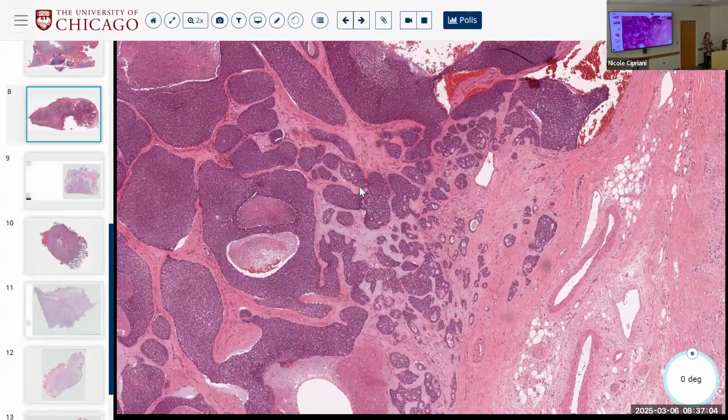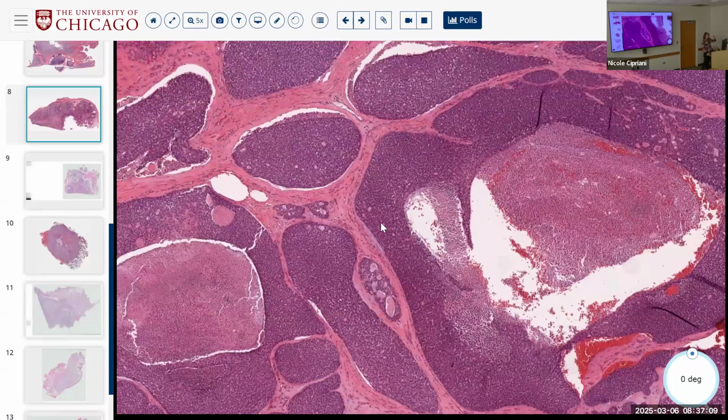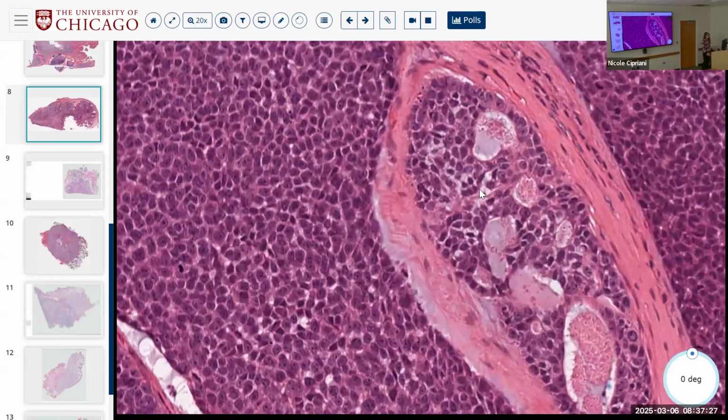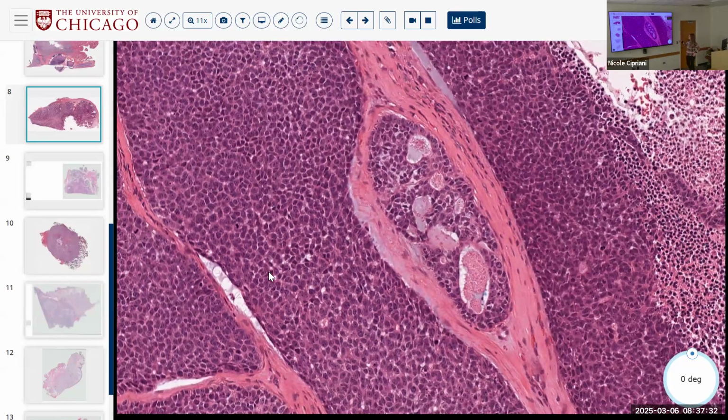So you also can have that on your differential because you have a suggestion in some areas of a background cribriform morphology in the absence of apocrine cells, but the presence of very, very blue, very basaloid cells. So when we think of very blue, very basaloid, certainly adenoid cystic is one of the things we want to keep on the differential, but the biphasic nature of this is not as apparent because you've got replacement of most of the lesion by these large high-grade cells with prominent nucleoli, mitoses, etc.